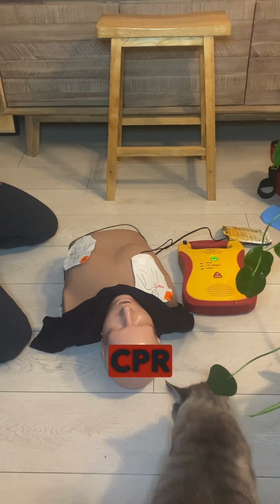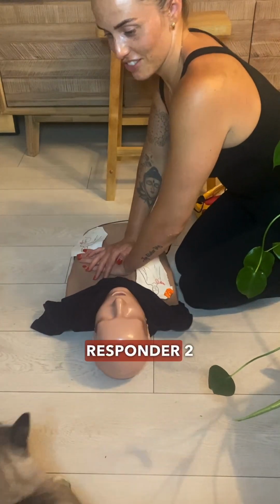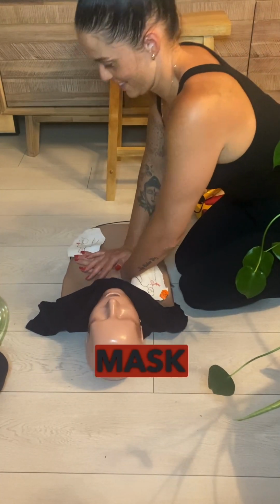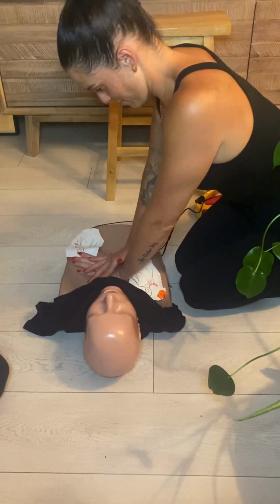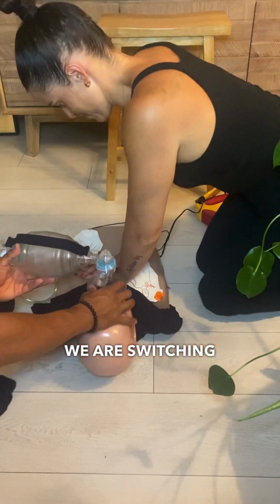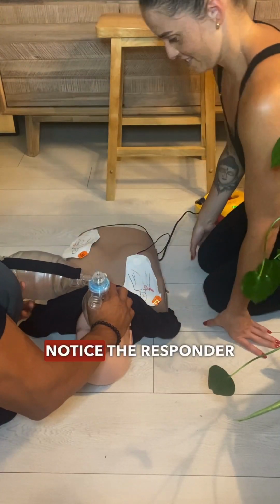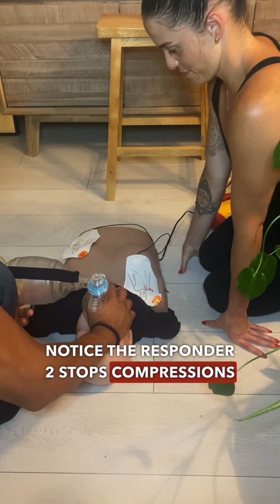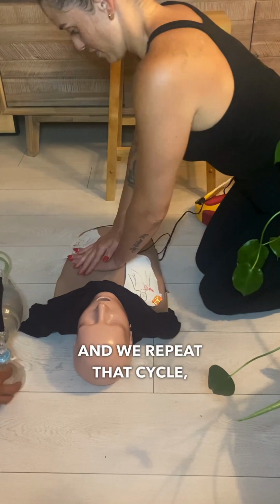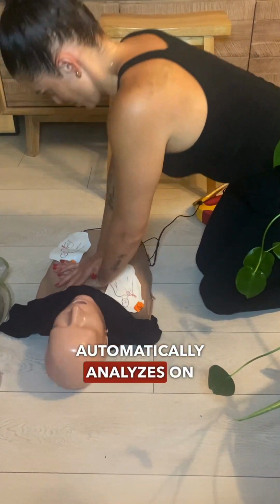Begin CPR now. Second round of CPR, responder 2 is now doing compressions while responder 1 is grabbing the bag valve mask if available. Because we have a bag valve mask or a barrier device, we are switching to 30 compressions to 2 breaths. Notice the responder 2 stops compressions for responder 1 to give 2 breaths. And we repeat that cycle, 30 compressions to 2 breaths, until the AED automatically analyzes on its own again.